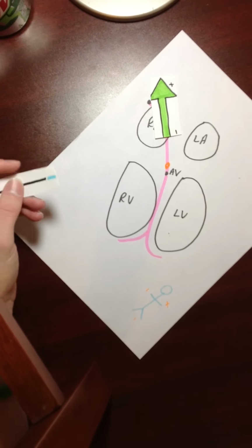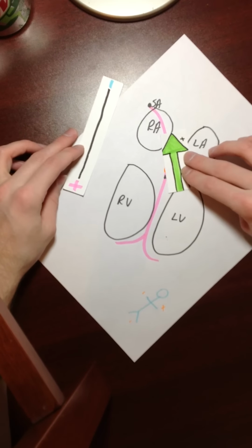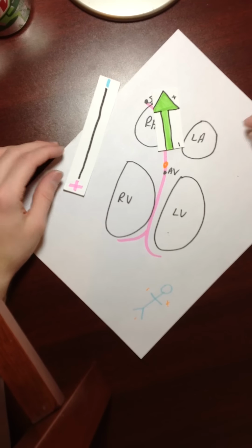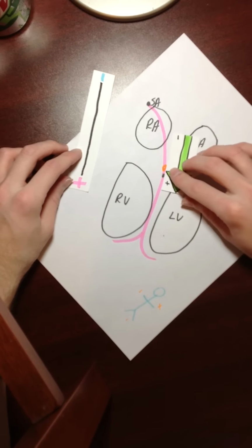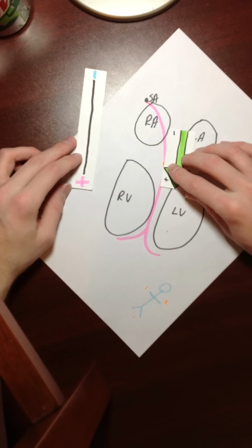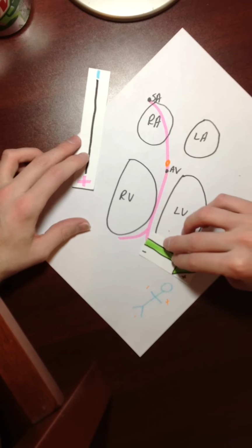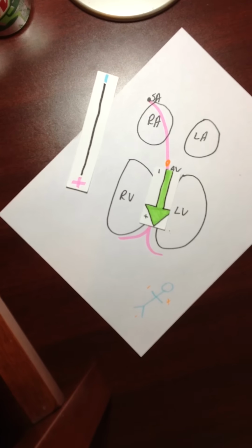So if I was looking at lead 2 here, okay, and this fires right here, what would you get? Well, you'd get an inverted P wave. Now notice that here, when this fires, it's going to go through and hit the AV node, it's going to pause, and then go through here, and it's going to look perfectly normal like it did earlier in a normal heart. Repolarization the same way.